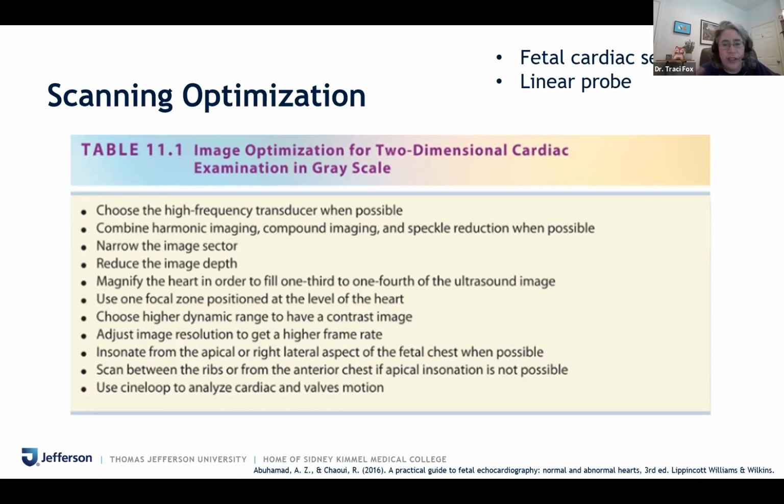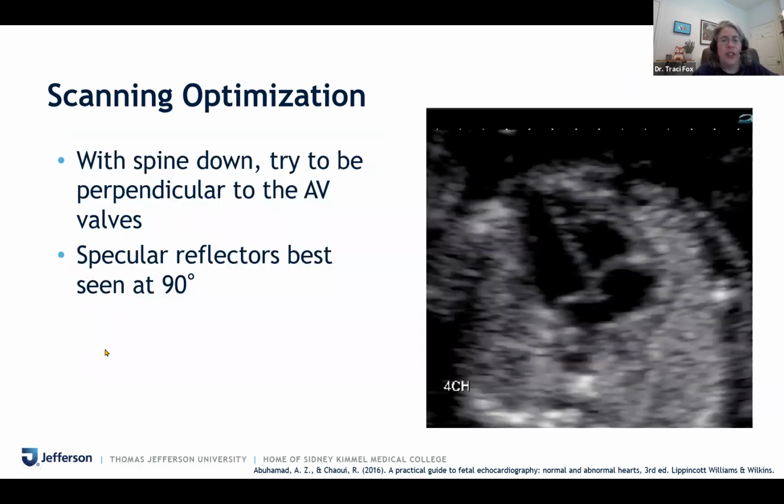And with ultrasound rapidly leaving, at least in the United States, leaving radiology, and everybody, literally everybody is doing ultrasound, you start wondering about how many people are just hitting the auto optimize button. Fortunately, obstetricians around the world that perform ultrasound are more familiar with these technical settings and how to optimize the images, which is good. It's especially important for fetal echo.